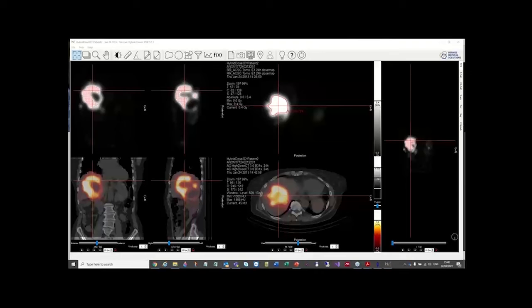I don't know if there are any further questions while we're on, but there's nothing currently in the panel there, Helena. So okay. Thank you very much for taking us through that. I don't know, did you want to take a look at the organ level dosimetry, or were you going to leave it there at that?